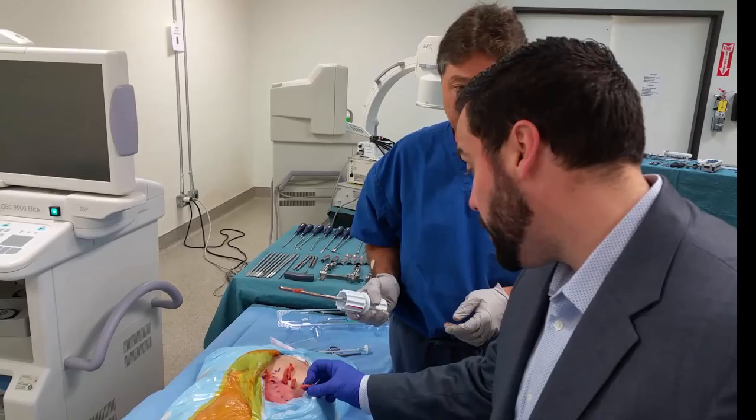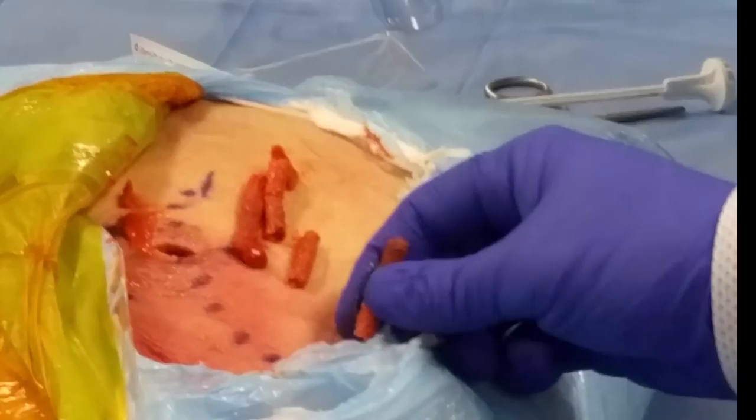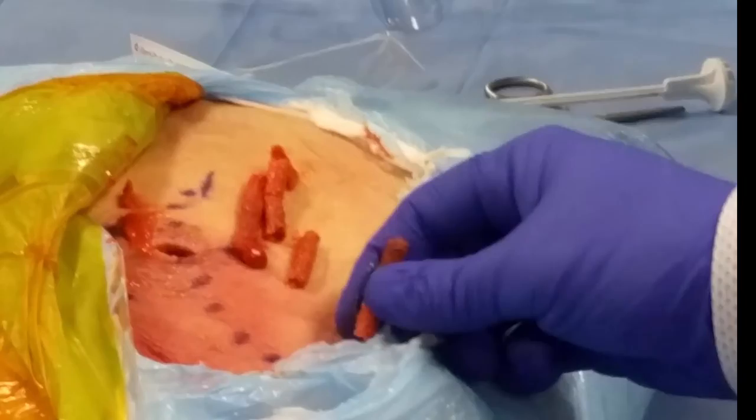Cylindrical cancellous pieces — there's no cortical bone in that. It's slightly compressed because of the insertion. And you saw that the process is not complicated. Most surgeons would be very happy to have that to do their fusion.